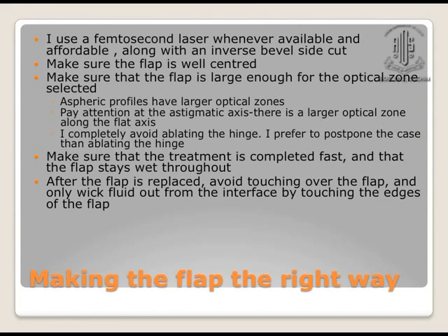In any case, even if you are using a microkeratome, it's a good idea to make a very well-centered flap. This will not only help you in your primary procedure, but it will also help you in case you need to do a retreatment in future. Because in my experience, even after 14 years, I've been able to lift a flap very easily, which means that you can do an enhancement anytime in life if you have properly recorded the initial flap formation, and if it was proper, of good size, good thickness, having a good exposure, you could do an enhancement even later on without having the need to cut a new flap, which can have many more complications.